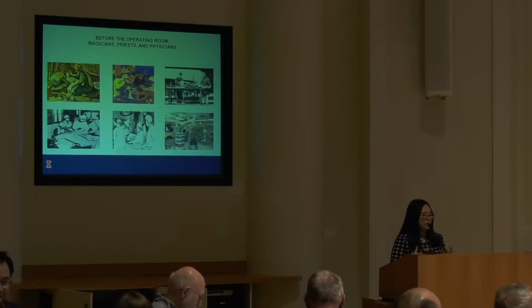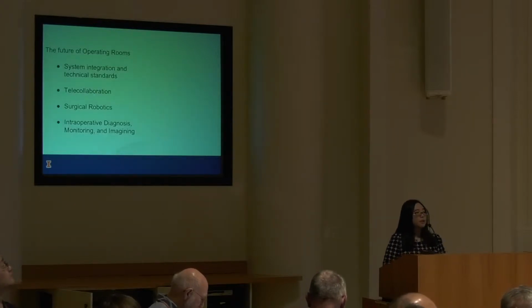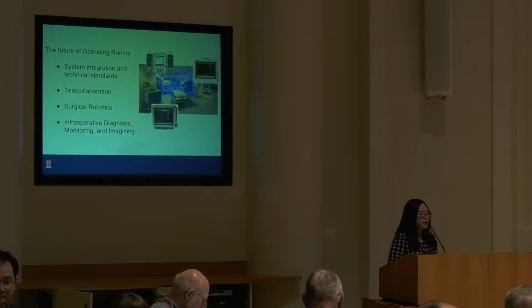Now we have a lot of modern devices connected in an operating room, and it is much more similar to a data center than anything before. Moreover, connection is also the trend of future operating rooms. For example, this is a picture of a modern operating room, and the patient in the room is usually connected to multiple devices, such as the insulin pump and several monitors. According to the measurements of the monitor, the insulin pump can automatically inject insulin into the patient based on the measurements, and this process does not involve any human intervention.